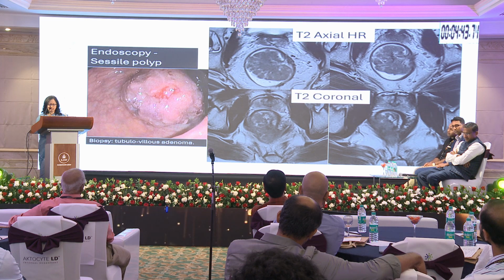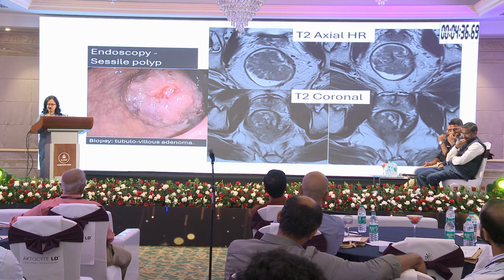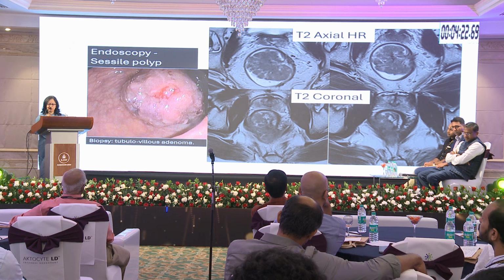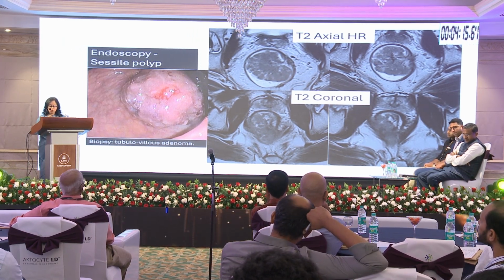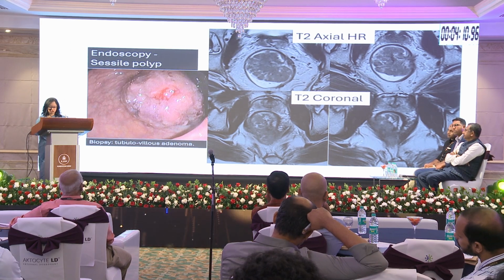So how does a radiologist avoid making that mistake? By understanding what is the invading margin of the polypoidal growth. Invading direction is from the head towards the base. So we know that the growth will first involve the pedicle, and it will go out of the rectal wall at this site, and so T4B is unlikely in this patient. So understanding the point of attachment of the polypoidal growth and the invading margin and the direction of the growth is critical in preventing overcalling this lesion as T4B. So again, this is helpful when we all work together.